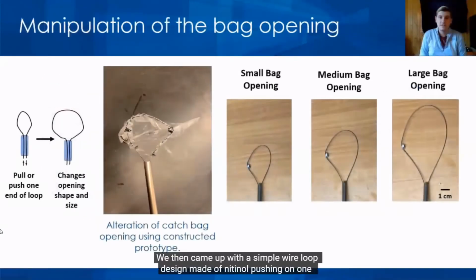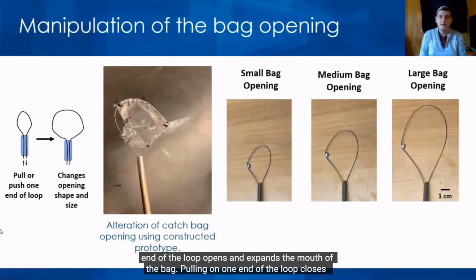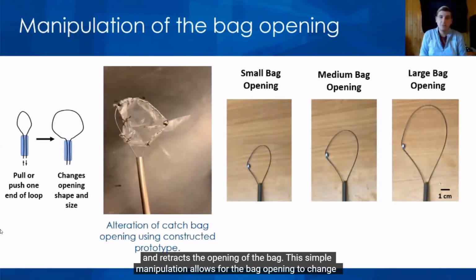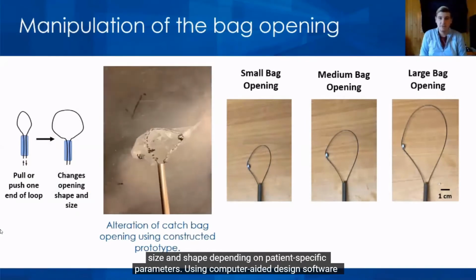We then came up with a simple wire loop design made of nitinol. Pushing on one end of the loop opens and expands the mouth of the bag. Pulling on one end of the loop closes and retracts the opening of the bag. This simple manipulation allows for the bag opening to change size and shape depending on patient-specific parameters.